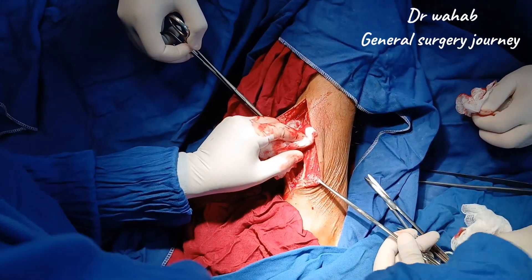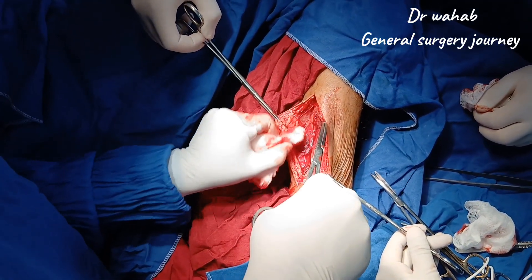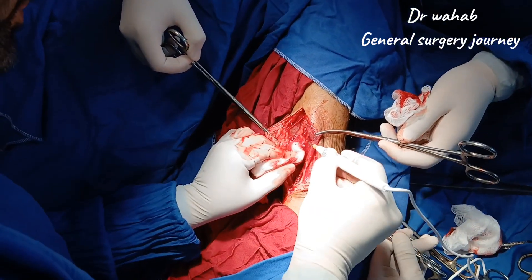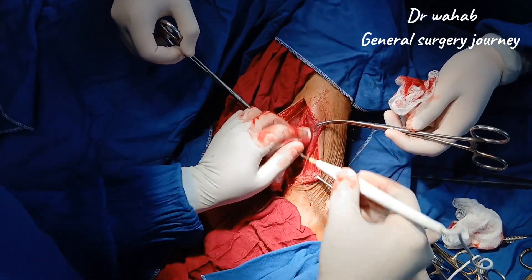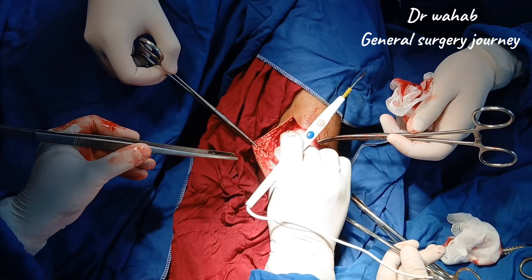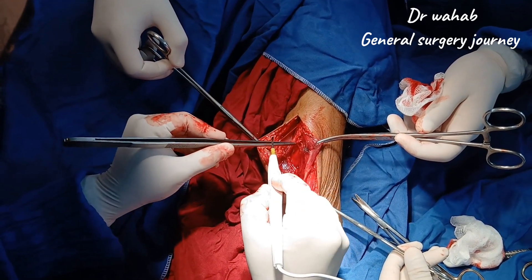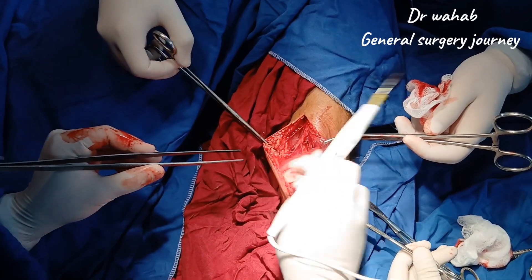The specimen is placed in a properly labelled container with 10% formalin for histopathology. The surgical bed is irrigated with normal saline and hemostasis is achieved. Now we are cauterizing some small vessels in the wound bed.